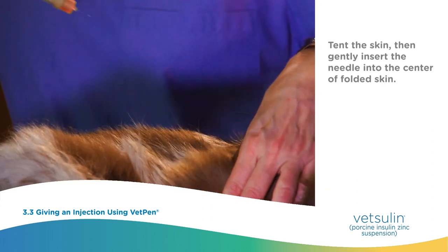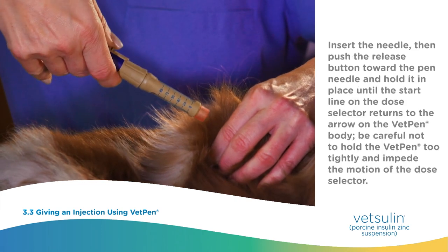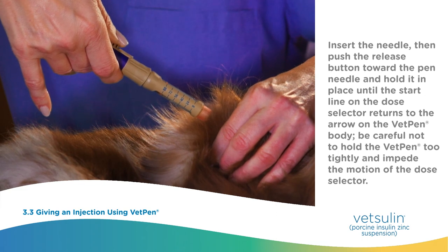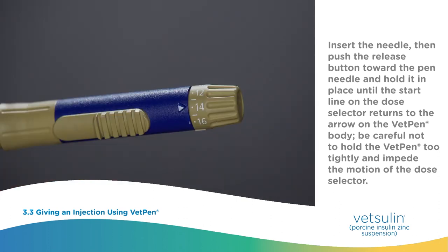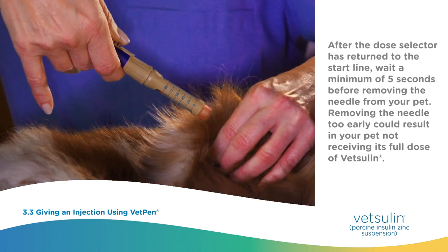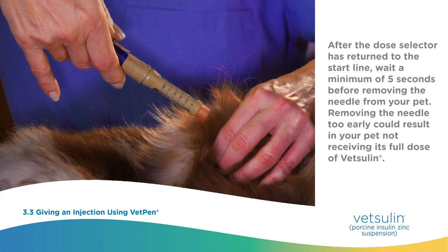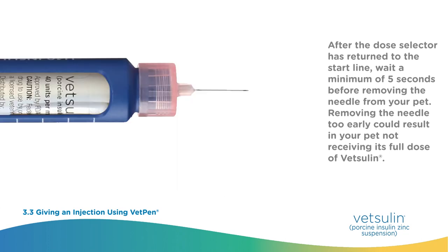Tent the skin, then gently insert the needle into the center of the folded skin. Push the release button toward the pen needle and hold it in place until the start line on the dose selector returns to the arrow on the VetPen body. Be careful not to hold the VetPen too tightly and impede the motion of the dose selector. After the dose selector has returned to the start line, wait a minimum of five seconds before removing the needle from your pet. Removing the needle too early could result in your pet not receiving its full dose of Vetsulin.